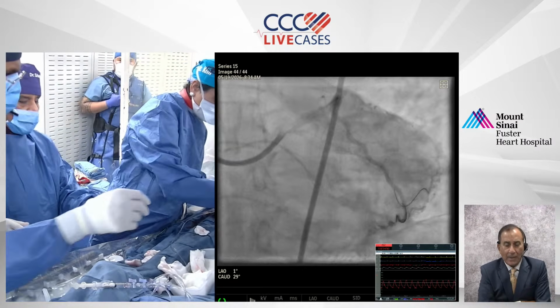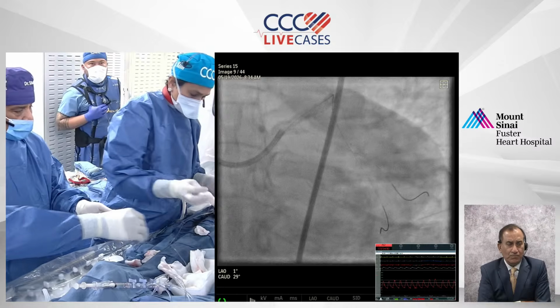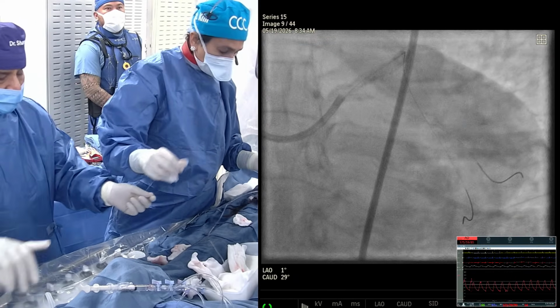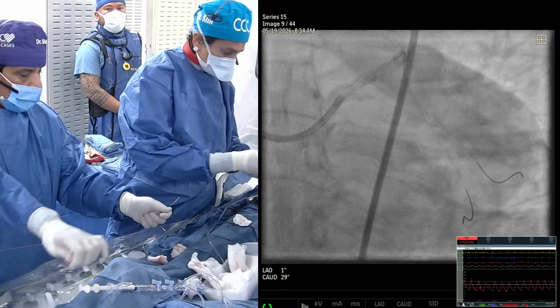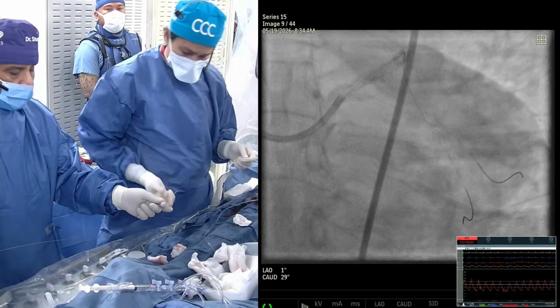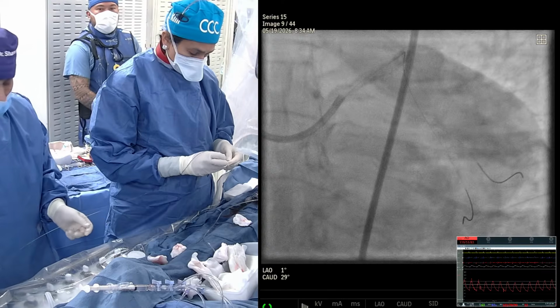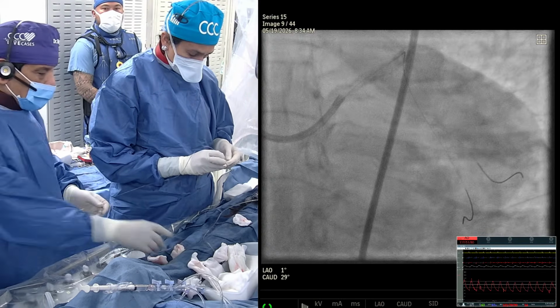Still, angiographically, if we had to assign, I would call it a severe calcium in the distal left main and proximal LAD. As you saw, when we did the MACE trial, this is now the IVL. When we did the MACE trial, Jeffrey Popma was still in Boston at that time.